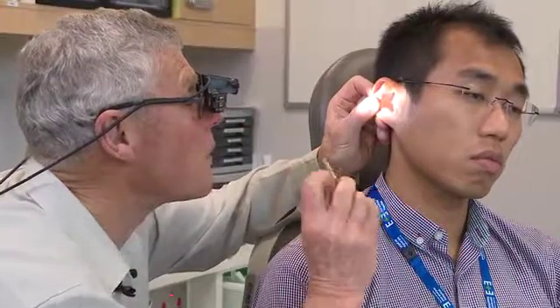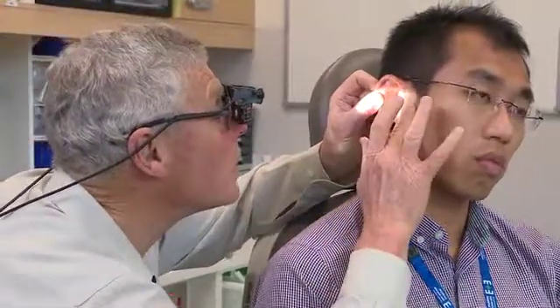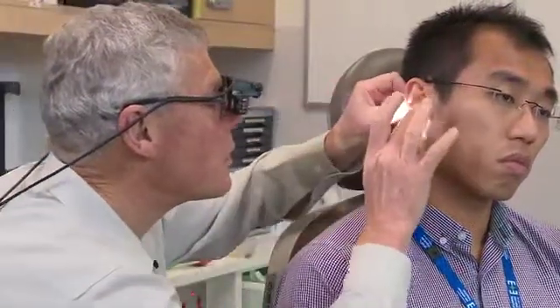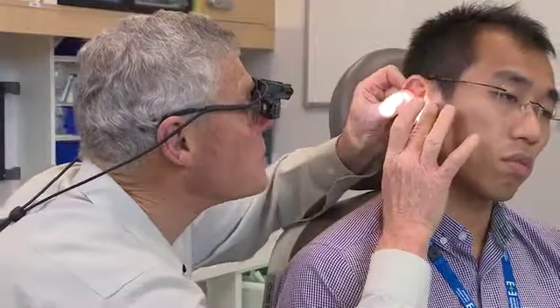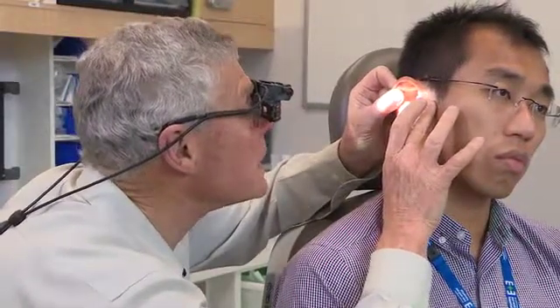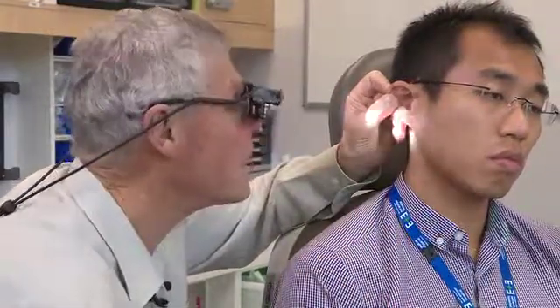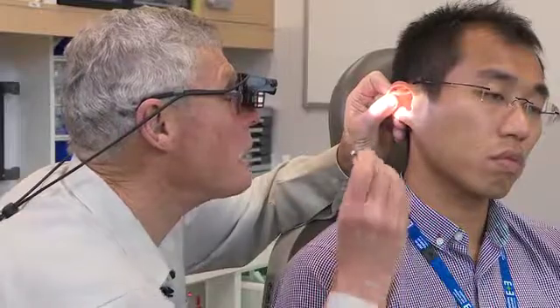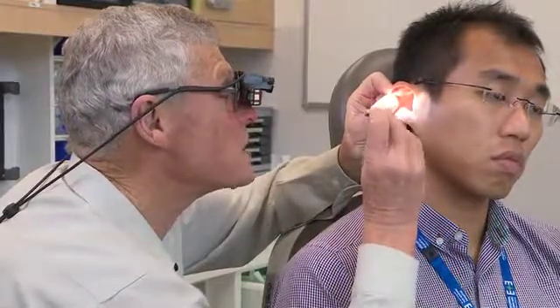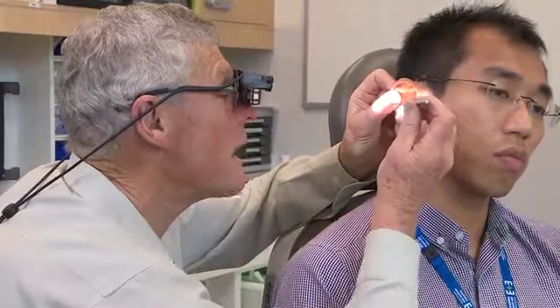And then you can go one further. Look a bit more, and probably now I'll look with a speculum as well. What the speculum will do in most ears is straighten the canal even more, and stretch it a little bit, and you will see more. But in this case, and in quite a reasonable number, you will see wax that's not at all far in, and then you can deal with it without a speculum.